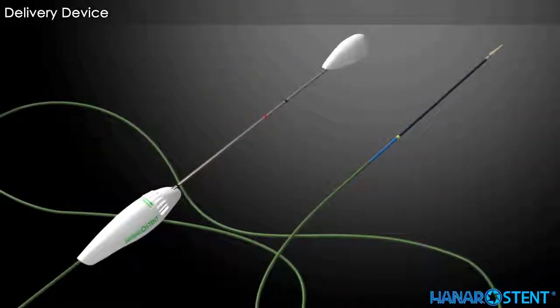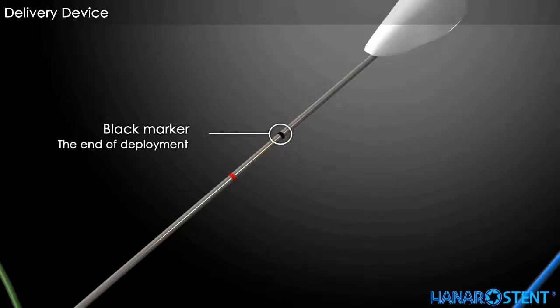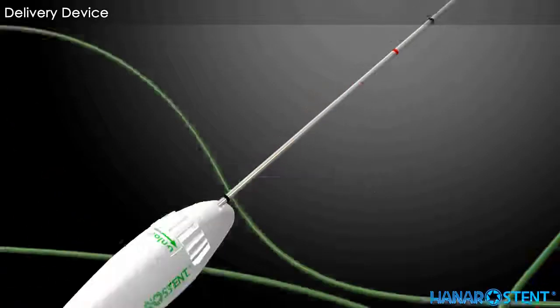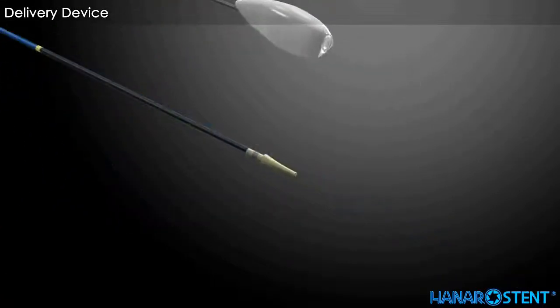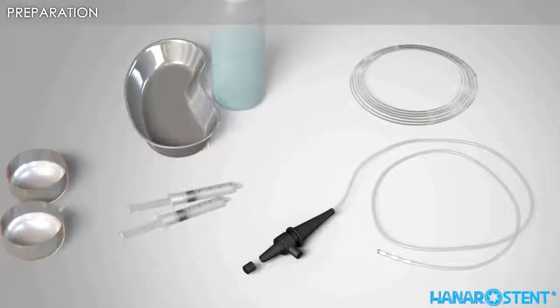This is the delivery device for the Hanaro Stent Biliary. A black marker on the delivery device indicates the full deployment of the stent. A red marker indicates the recapturing limit, or point of no return. The locking system prevents accidental deployment during placement. A yellow marker indicates the proximal end of the preloaded stent. A radiopaque ring aids excellent awareness of the deployment procedure through fluoroscopy.